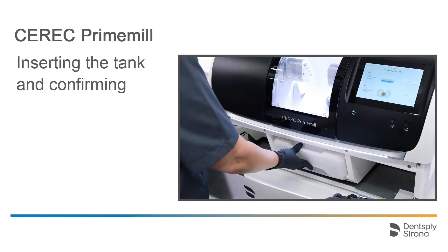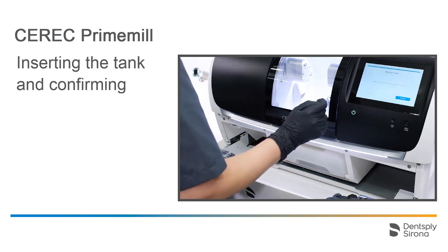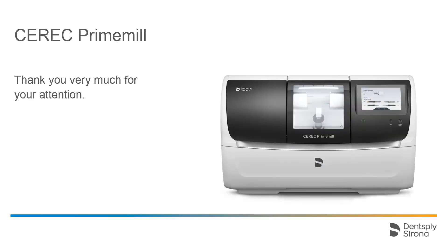Lastly, we insert the tank again and confirm the change on the touch interface twice. Thank you very much for your attention. We would like to wish you every success when working with CEREC Prime Mill.